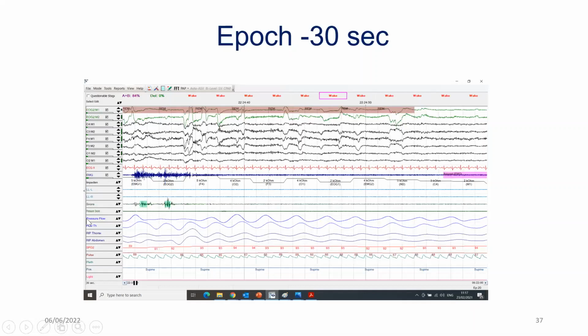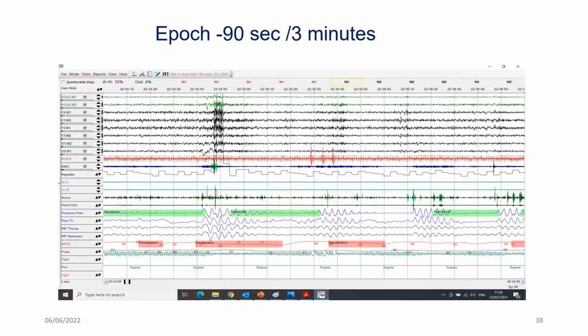An epoch is the number of channels or waveforms that we see on a screen, like EOGs, EEGs, ECG, EMG, leg movement, snoring, pressure snore, and all other channels like respiratory channels, shown in a 30-second window. Similarly, when we score apneas or hypopneas, we look at a 3-minute epoch.